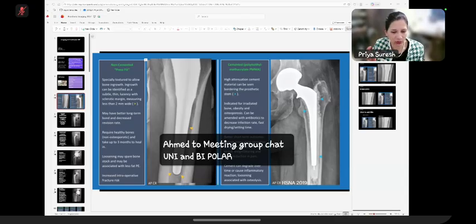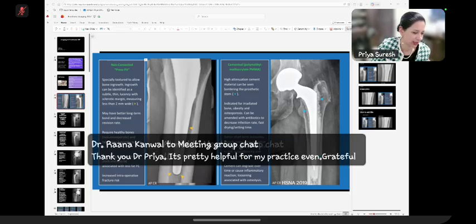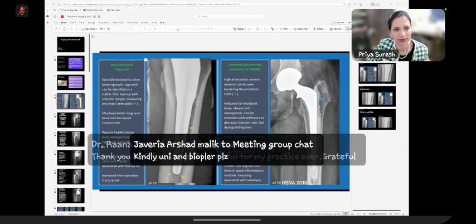Shoulder is coming now, quite a lot of shoulder. Our shoulder surgeons were saying the curve is going quite vertical with the numbers. But I think hip and knee are the main ones that people will see. So if they're able to identify that, that will be good. Maybe next time I can try and touch the knee complications.